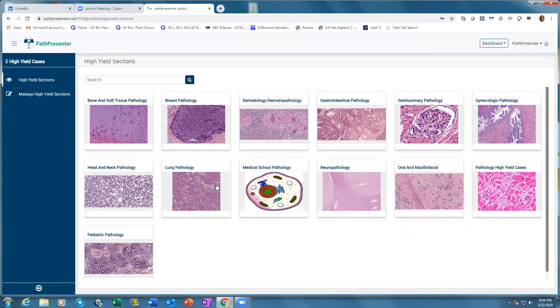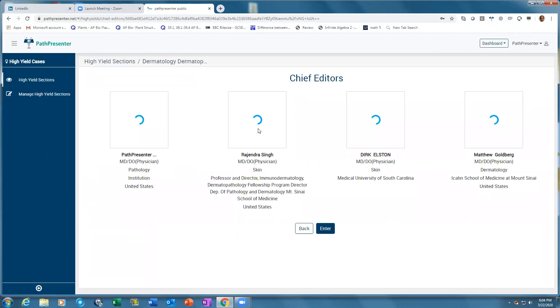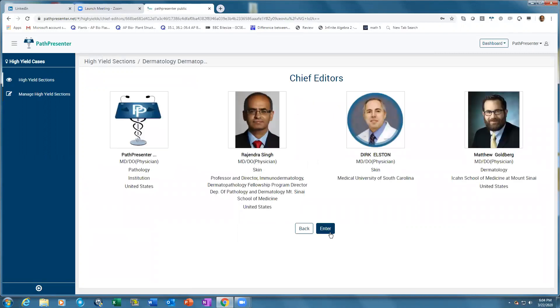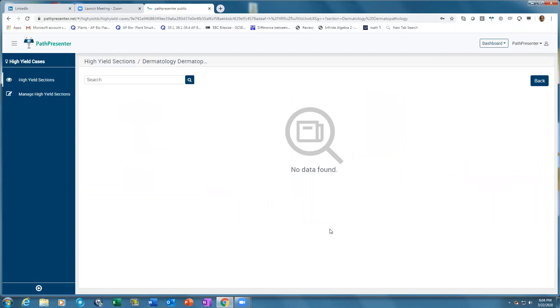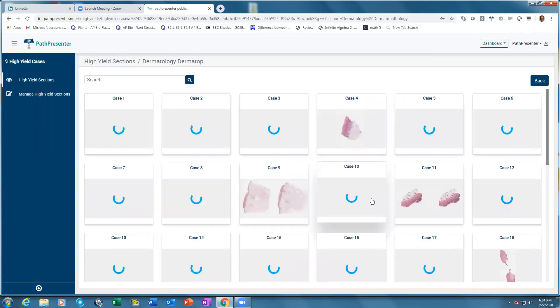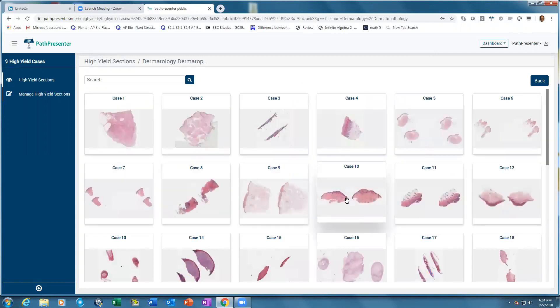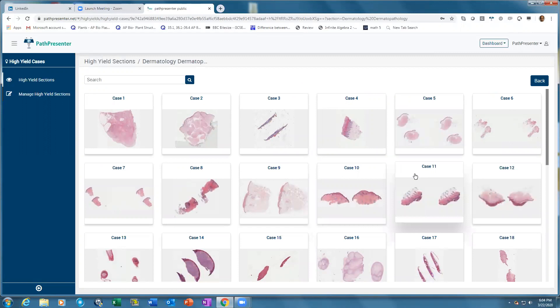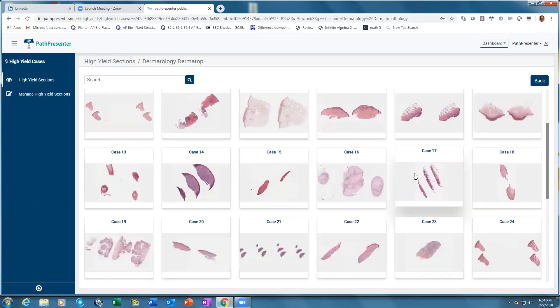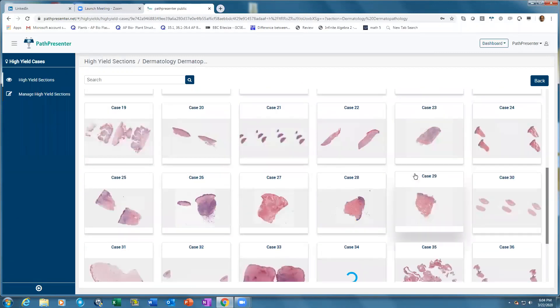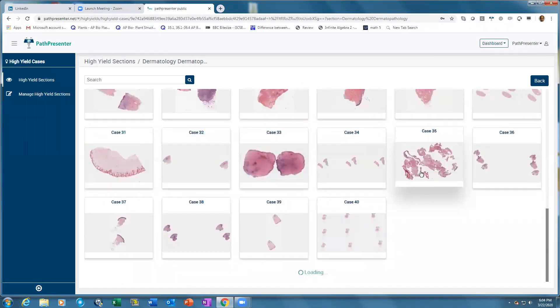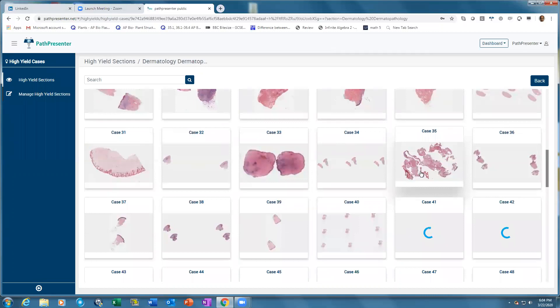If you click on any of these — I built the dermatology section, so I'll show you the Derm Path. You click on any of these and enter. I picked around 300 cases that every resident should know before they finish residency, or every fellow should definitely know before the end of their fellowship.